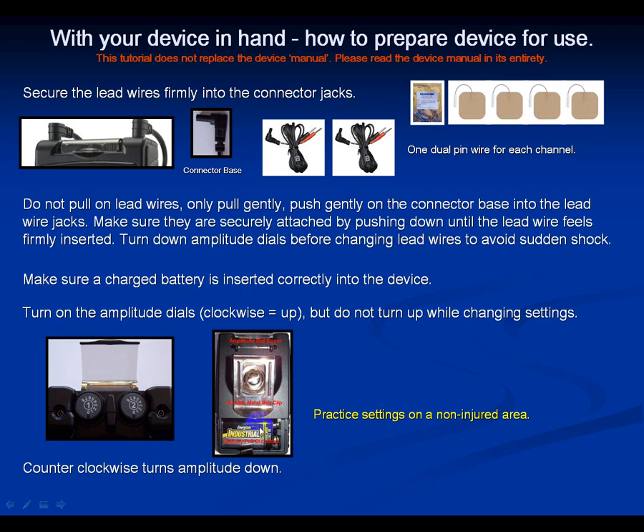Make sure your charged battery is inserted correctly and turn your device on. Take two pins from one wire and attach them to the pigtail section, and the other two pins from the other wire attach to the other pigtail section. We're going to practice settings on a non-injured area — start with your left or right thigh. Take one lead wire with two electrodes and put it on the inside of your thigh, and the other lead wire with two electrodes on the outer part of your thigh.